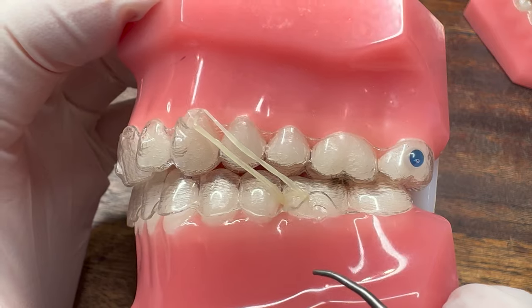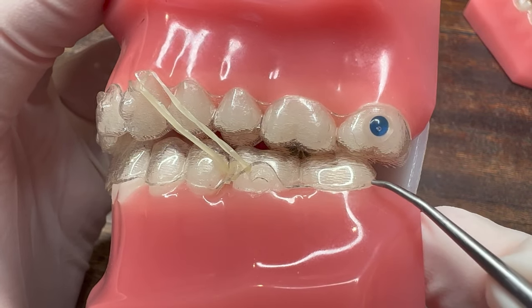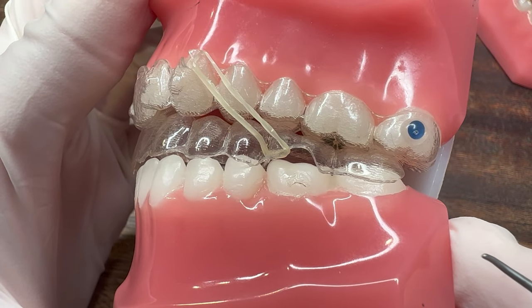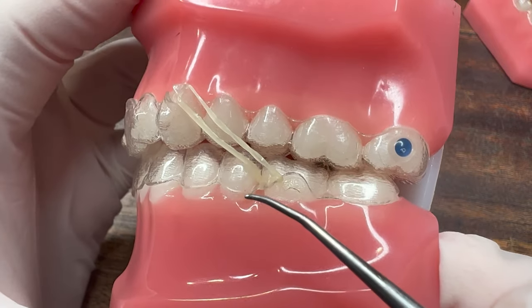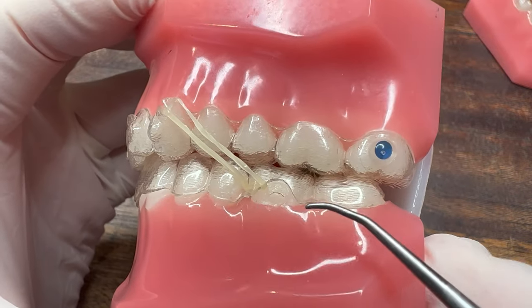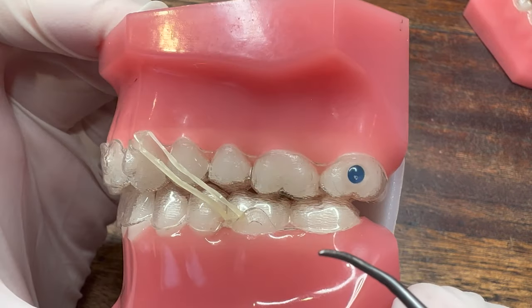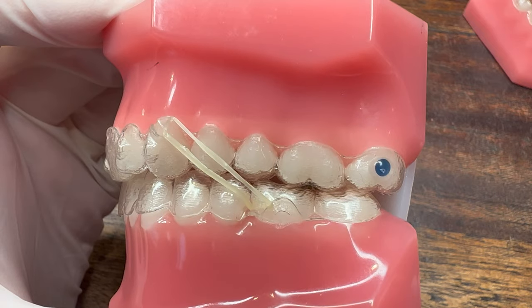There's one thing you have to be careful with — it will make the aligner pop off easier. If you have a lot of attachments, unlike this model, it is less likely, but you'll need to continually bite down to make sure it doesn't fall off, or even switch to a weaker sized rubber band temporarily.